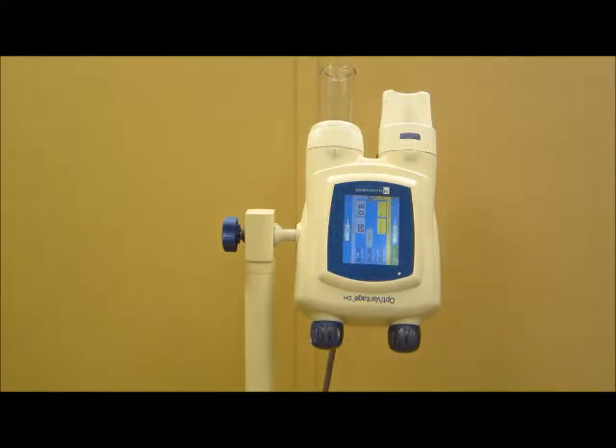This video will take you through the steps required to properly install the KOUR C859900 front load adapter on the OptiVantage dual head injector.